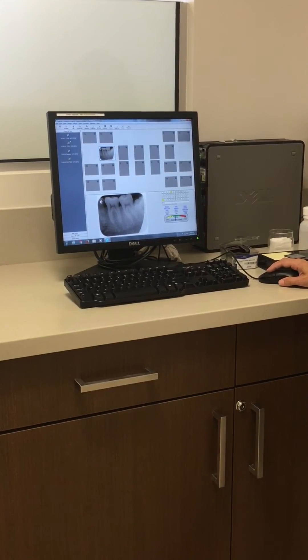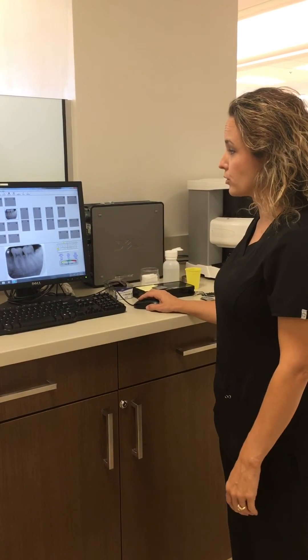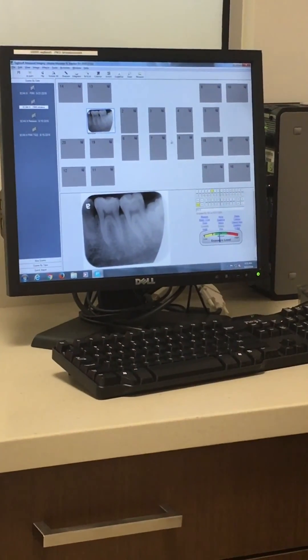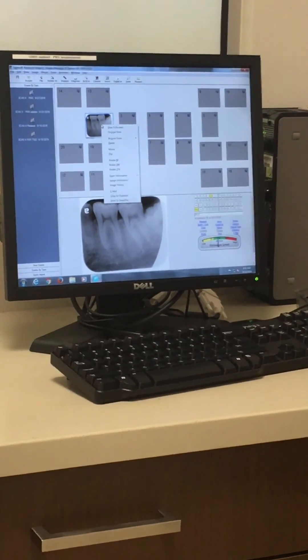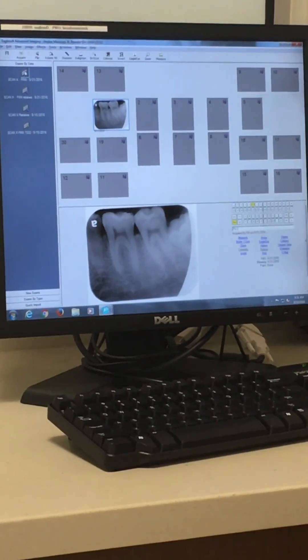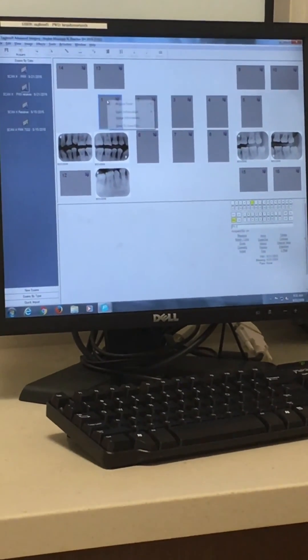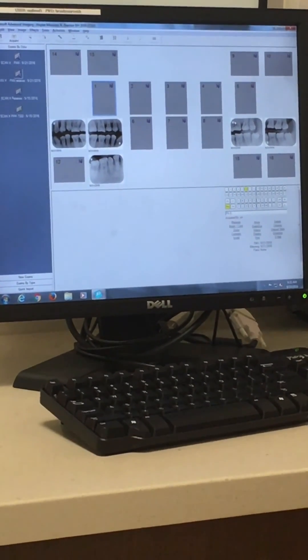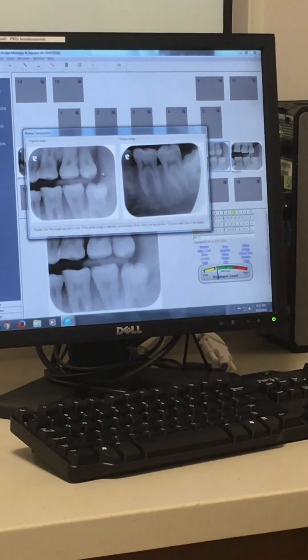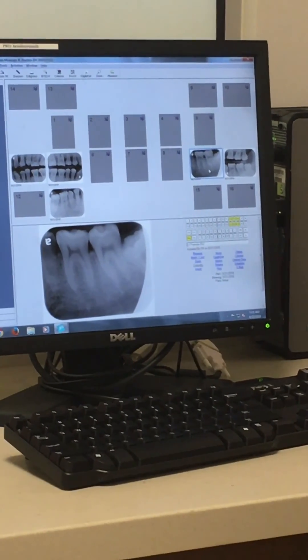To move the retake into your original FMX — which you'll be submitting for the dentist's diagnosis and for grading — right-click and relabel the retake exam as ScanX FMX Retakes to avoid confusion. Then right-click the retake image and copy it to the clipboard. Go back into your original FMX, right-click the image you want to replace, choose Acquire From, and select Acquire from Clipboard. It will ask you which image you want to keep — confirm the new image, and it will replace the old one, sending it to the recycle bin.